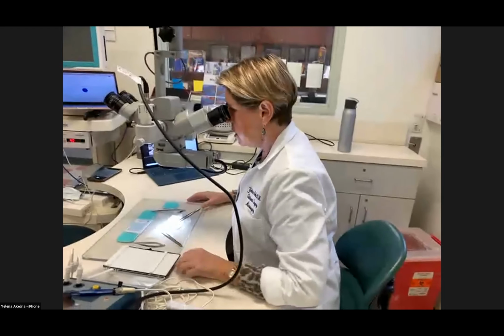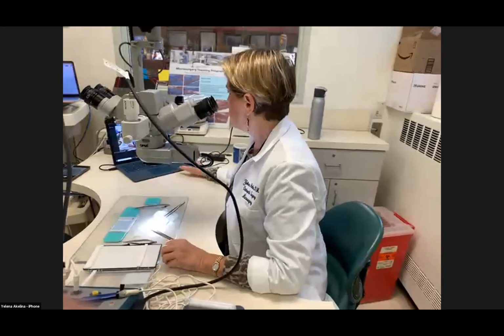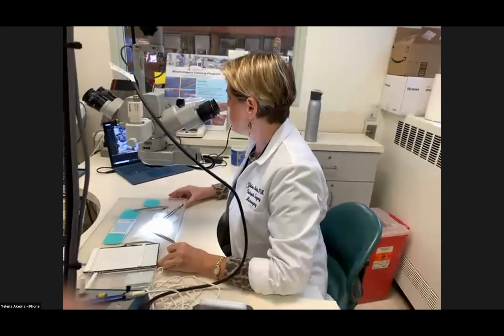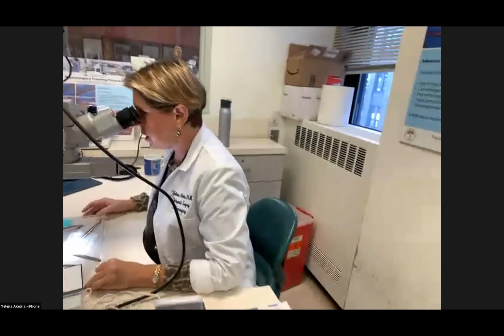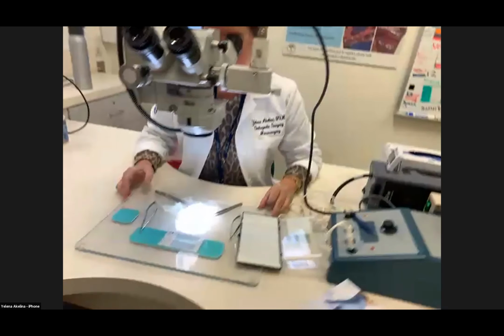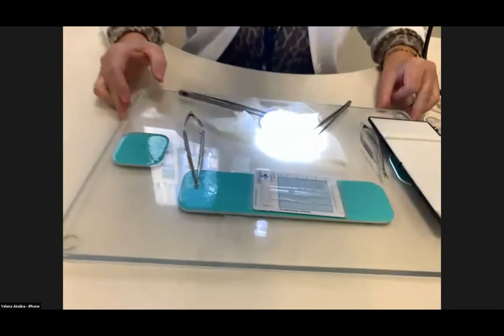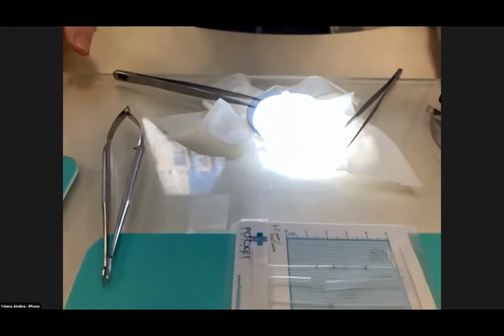And then you're going to zoom in. So you can look at my screen where the microscope is, and you can see that I'm zooming all the way in on the highest magnification, losing focus. And then I'm going to focus it, being on the highest magnification.